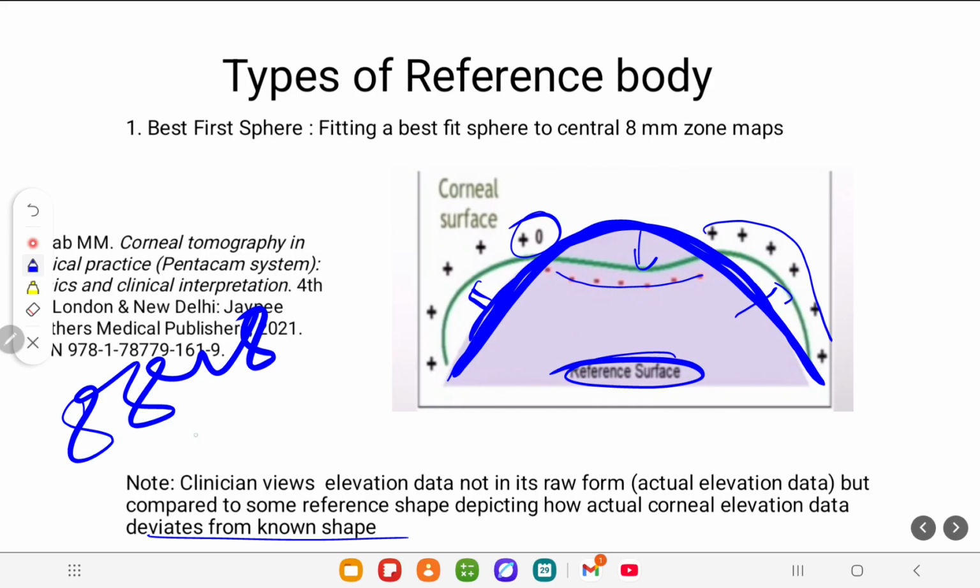No, because sea level is a reference. That's why Mount Everest is at 8848 meters, isn't it? It's very simple. That's why we need that sea level. We need a reference, and when it comes to reference, we always tend to talk about best fit sphere.